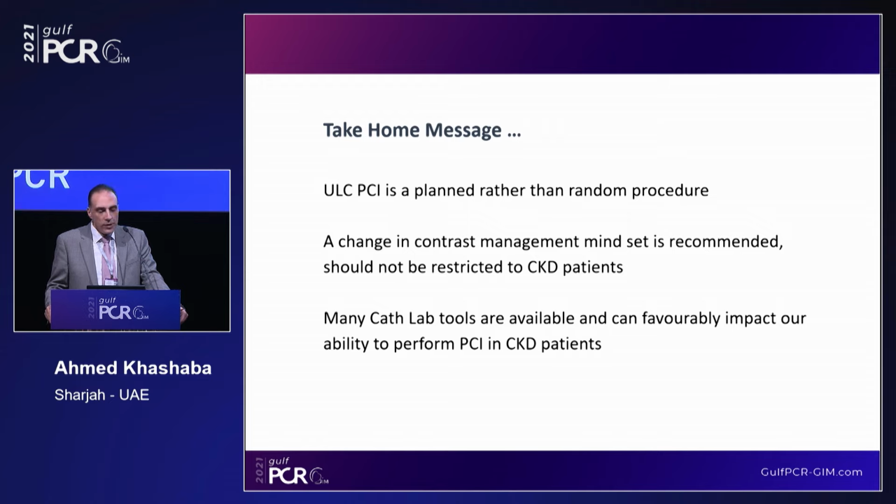So my friends, my take-home message for today is that ultra-low contrast PCI is a planned rather than a random procedure. You have to plan it beforehand. And this requires a change in the contrast management mindset. You have to plan and change your habits in the cath lab to achieve this goal.